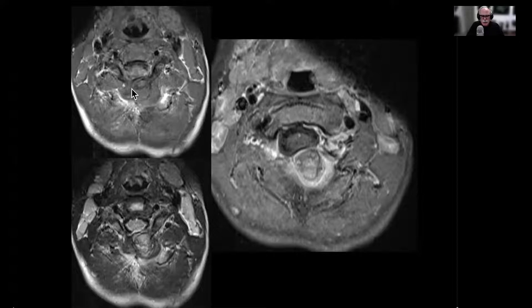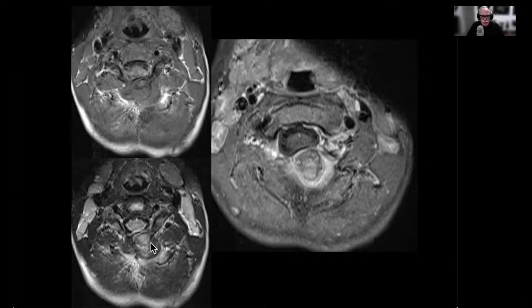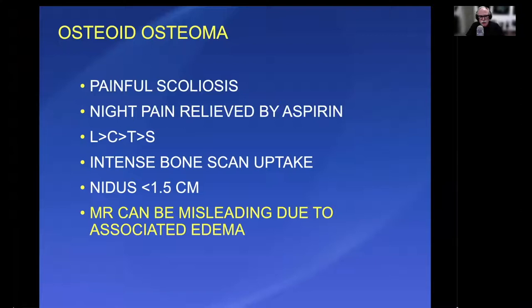It looks a little bit more challenging on MR. CT is a lot easier to diagnose. These are kind of nonspecific on T1, with an irregular enhancement pattern and heterogeneous on T2. I think I would be fairly dumbfounded trying to figure out what it was if I just had the MR study. So the combination of CT and MR is often very helpful.